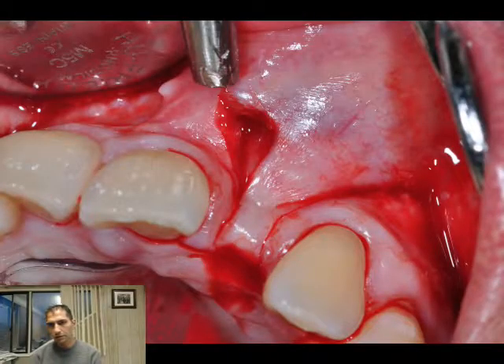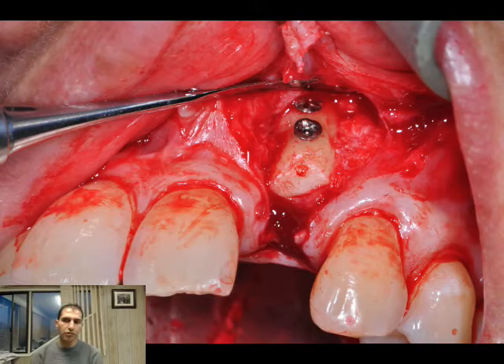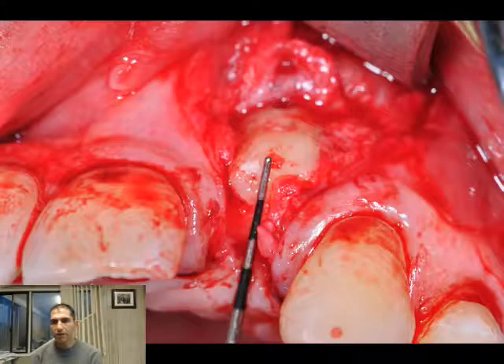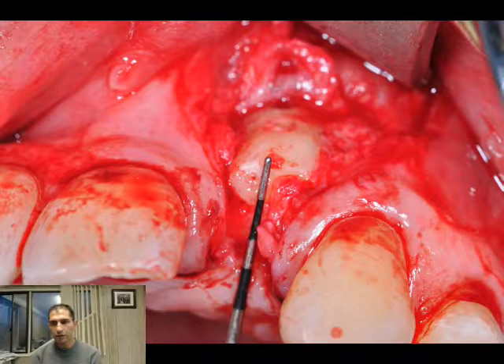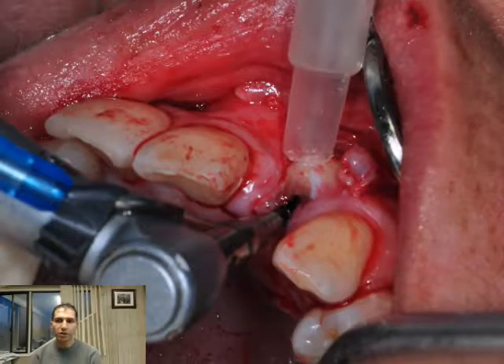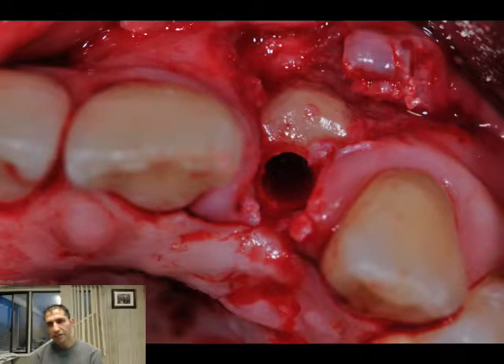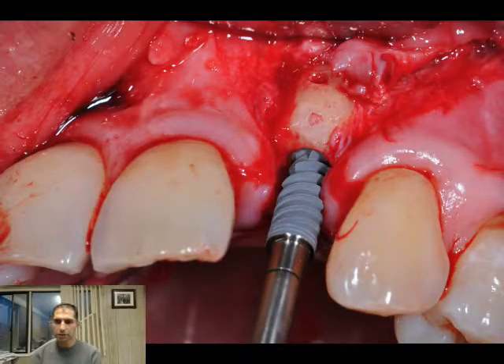This is the closure with microsutres. These are pictures of the fixated graft and the complete closure. After three months, this is the re-opening where with a papilla-sparing incision we can expose the graft. You can appreciate the amount of bone achieved and you can see the bleeding points on the graft. This is the preparation design for implant placement and three-dimensional positioning.